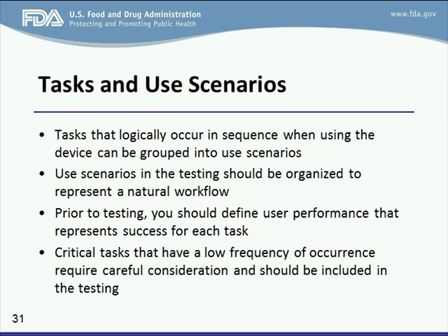Can you repeat the question again, please? I mean, your comment again. Again, when you're executing these usability studies, is there a specific template in terms of the detail that you want to see in the report for the pre-market submission? Yes. The report is outlined in the appendix. Within the appendix, there's an outline that goes through some of the detail within the report structure. Again, that's a recommendation of the report and how that information can be laid out so that it conveys easily to the reviewers and we can quickly understand your critical tasks and what your focus was on during the summative testing.